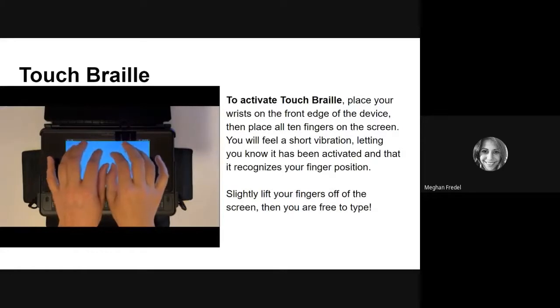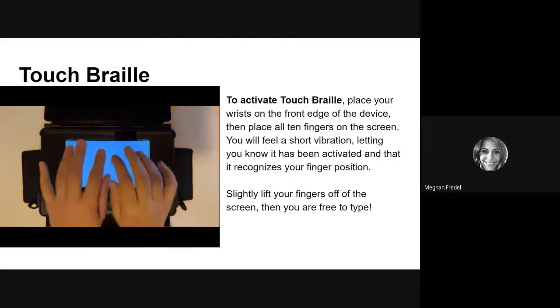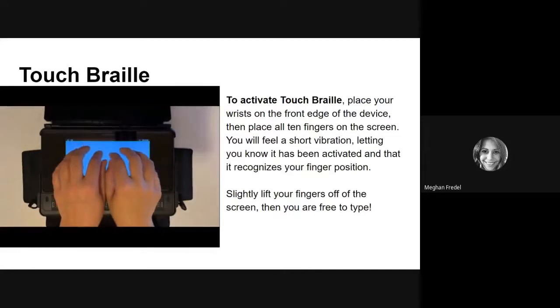How. Erg. So I wanted to write, hi, how are you? And I ended up writing, hi, how are ERGH. So it definitely takes a little bit of practice. And I also think I moved my wrist position a little bit. But if I want to reactivate it, all I do is, again, gently put my wrist down, set my fingers down, lift up, and then go ahead and type.